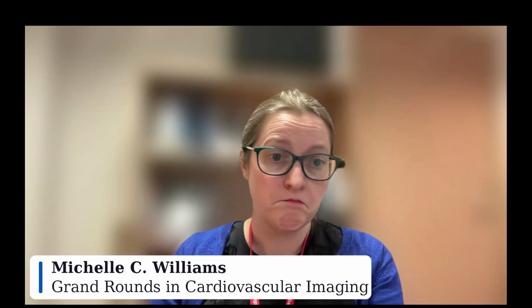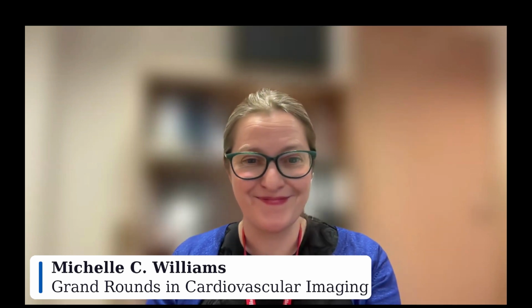We're definitely going to identify lots of coronary artery disease in people who didn't know they had it. That's going to be a certain one. But does giving them treatment improve outcomes? We'll soon find out. So you were in the SCOT-HEART 2, you will read the CT cases and you will disclose the result, and then the referring physician can adapt or start or intensify treatment. Is that correct? We send the information to the patients themselves as well.